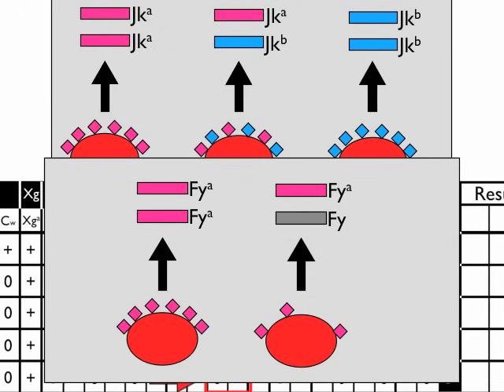So it's important to recognize that we assume that we're seeing double dose, but we may not necessarily be, and you have to pay attention to that when you're doing your workups.